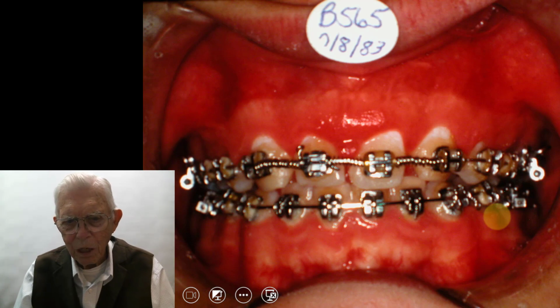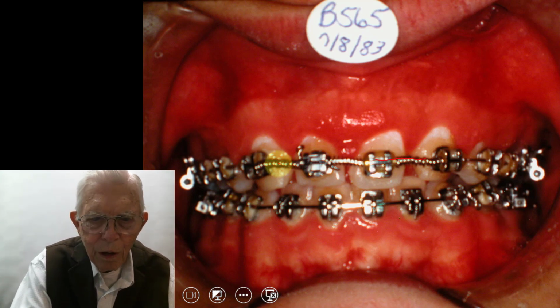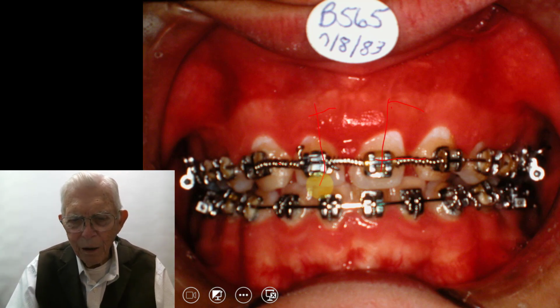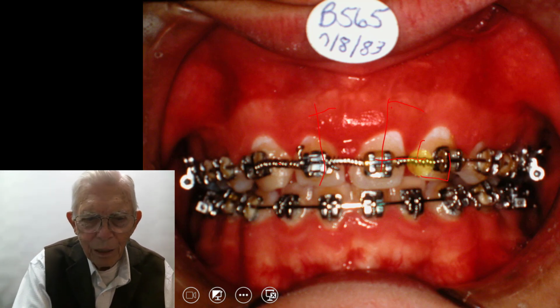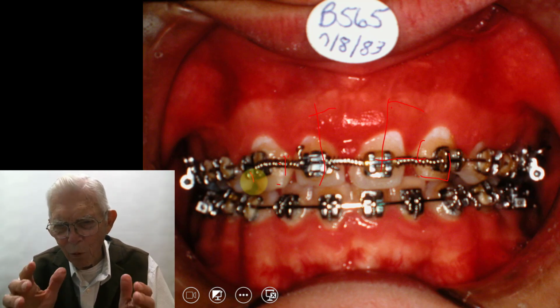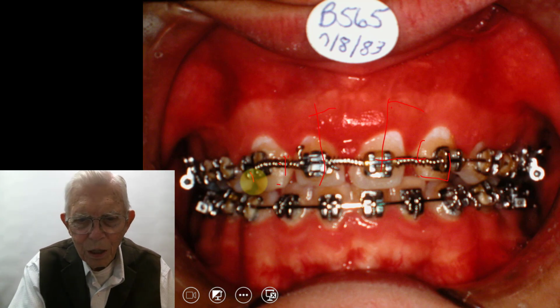So we got the teeth in place, and then we put some springs in here and pushed these teeth over and brought the roots of the laterals up in like this. And then after we got them in there, these cuspids were kind of shaped like laterals, but we didn't make them more narrow, hardly any. And we pushed these teeth together.